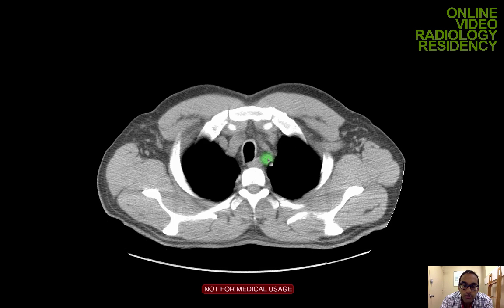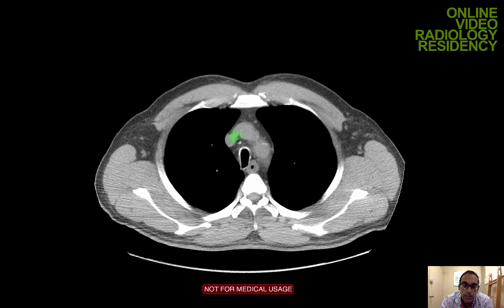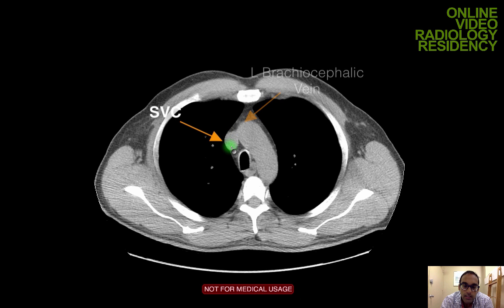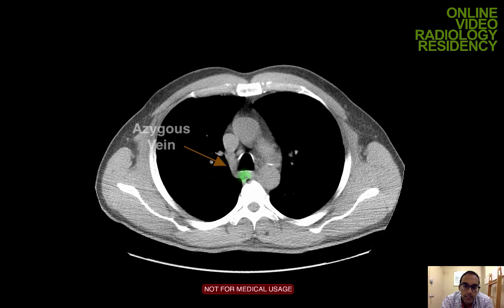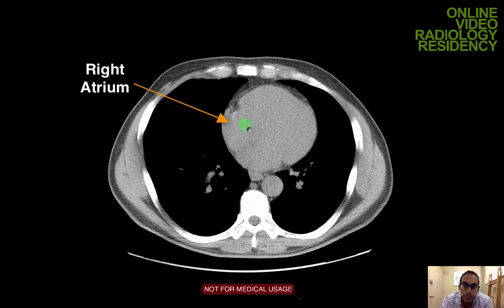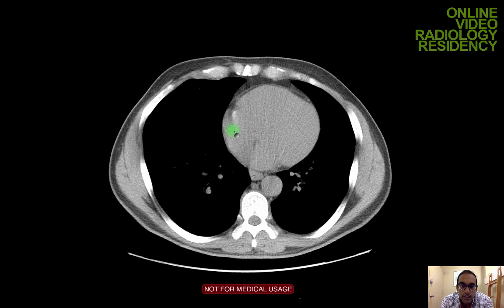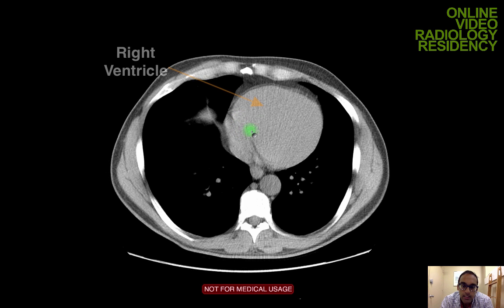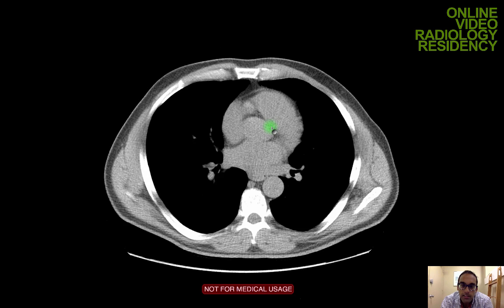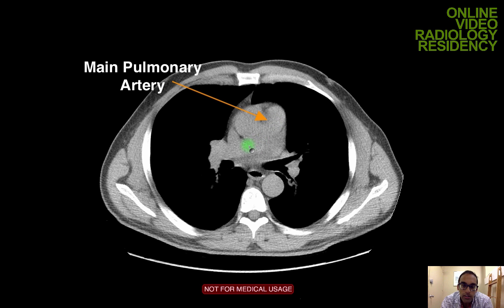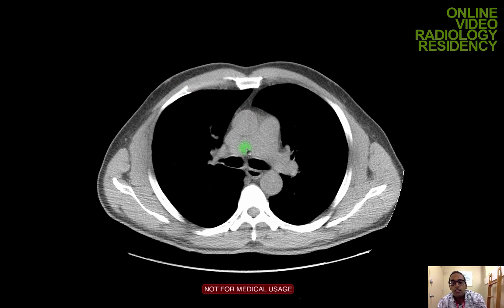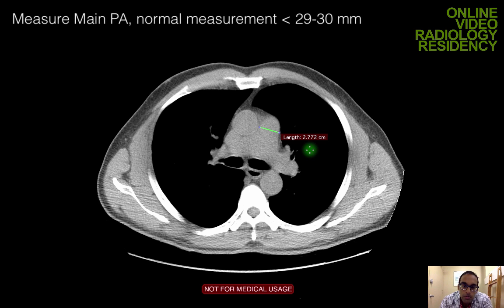Next I look at the vessels. I can see the venous structure to the right of midline — the SVC — receiving blood from the brachiocephalic vein, with the azygous vein coming in posteriorly. Coming down, I can see the right atrium and right ventricle. I assess the right ventricular outflow tract, the main pulmonary artery, and the right and left pulmonary arteries. I measure the main pulmonary artery to exclude pulmonary arterial hypertension — this person is at 27 mm, which is normal; the upper limit is 29 to 30 mm.